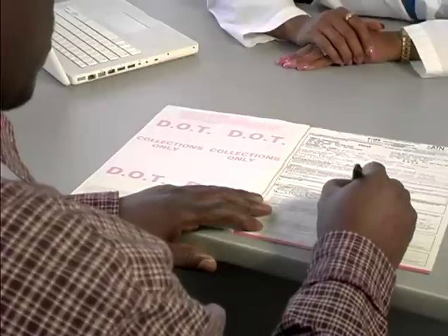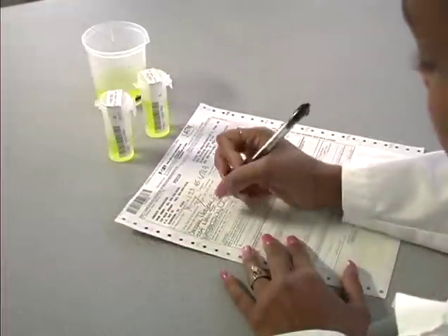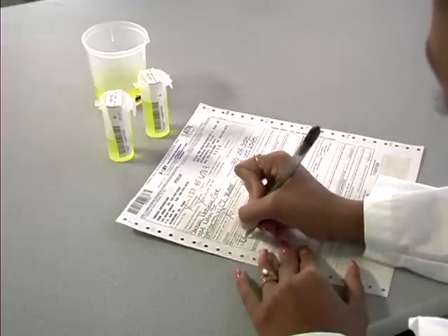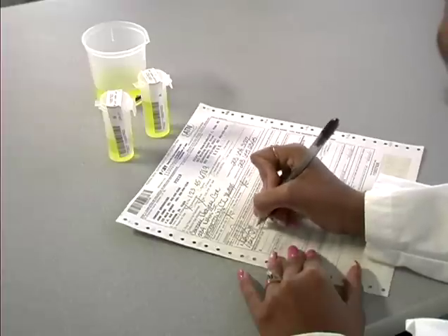Once the specimen bottles are sealed and you have discarded excess urine, have the donor complete Step 5. Without detaching Copy 1, open the Custody and Control Form to Copy 2 and instruct the donor to read and sign Step 5, the certification statement. Next, you initiate Step 4 of the CCF by signing and writing down the time and date the specimen was provided. Write down the name of the courier service that will be transferring the specimen to the laboratory.